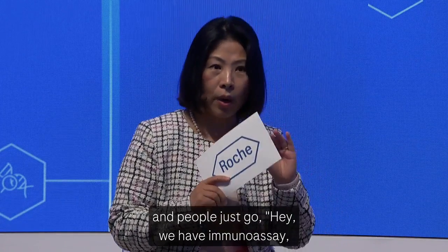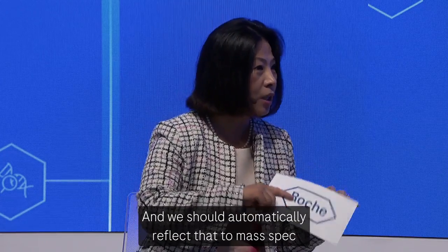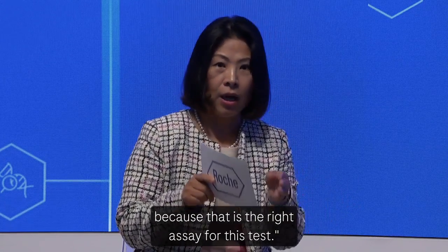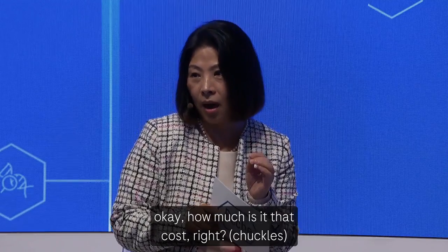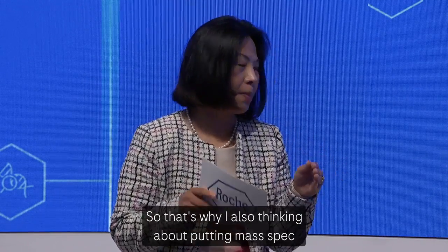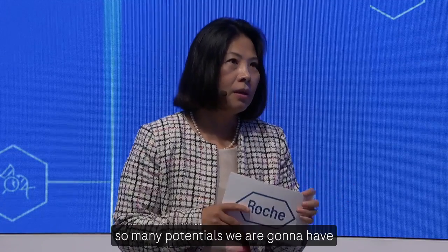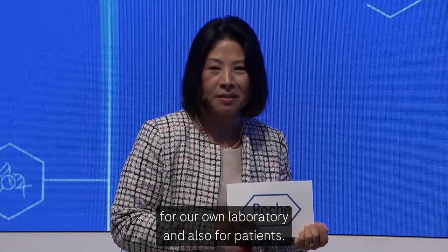And people just go, hey, we have immunoassay, and we should automatically reflect that to mass spec because that is the right assay for this test. So rather than thinking about how much that costs, that's why I'm also thinking about putting mass spec right next to the immunoassay analyzer. There are so many potentials for our own laboratory and also for patients.